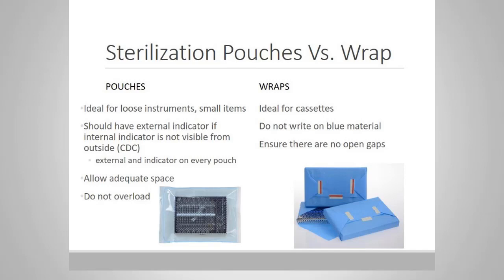Wraps are ideal for cassettes. Don't write on the blue material. And make sure that there are no open gaps within the pouch. It should be wrapped tight like a gift.